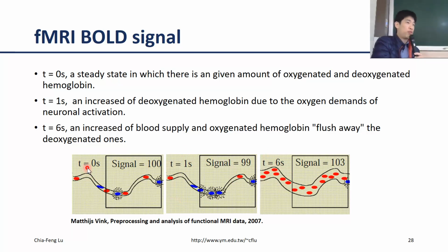As we mentioned before, there is a time delay after the neuronal activity before the vascular response will happen. There is a 1 to 2 second time delay, okay? So we take these 3 plots as the example. You can see the first one. If now it is time 0, that means it's more like the resting period. That is more like the baseline. Your brain is doing nothing.